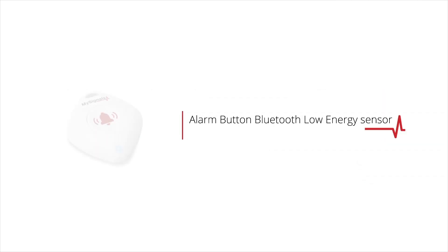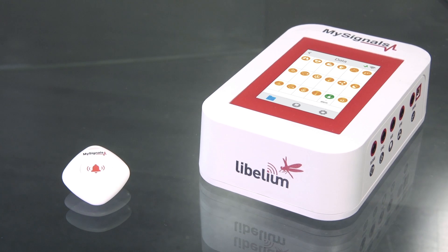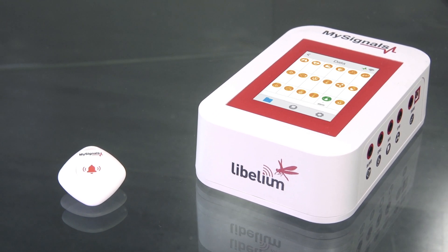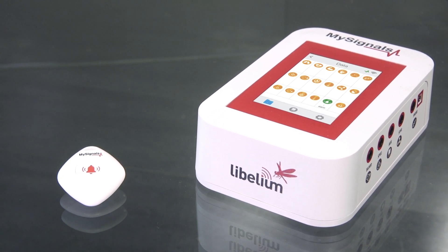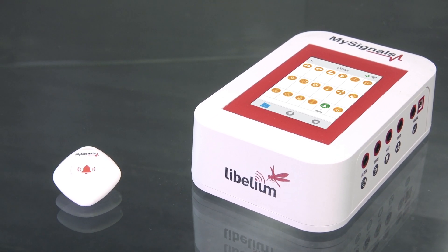How to use the Alarm Button Bluetooth Low Energy Sensor in MySignals. Bluetooth Low Energy sensors are paired with the MySignals development platform. You only have to switch on the sensor to send data wirelessly to the MySignals board.